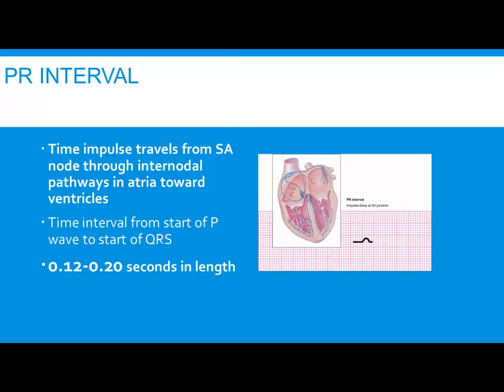And it's a little weirdly worded, but it's actually the time interval from the start of the P wave to the start of the QRS complex. Okay? This is important. Write it down. 0.12 to 0.20 seconds.